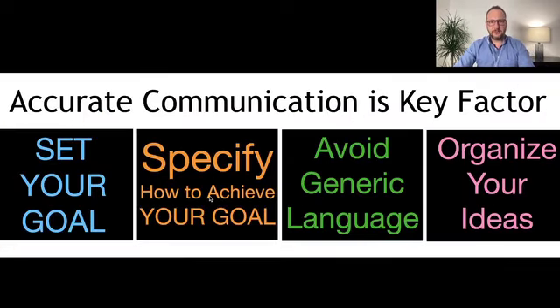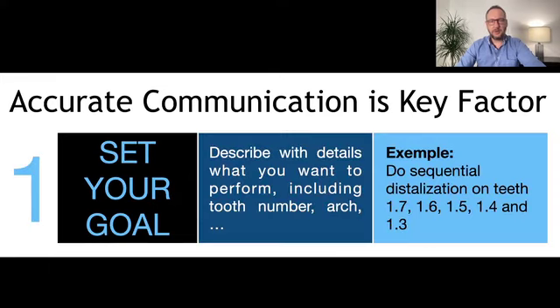So these are the final tips here about staging that you maybe can use tomorrow if you want, okay? But it's going to serve for us to understand how we're going to plan the cases in the future webinars, okay? So you need to follow these 4 steps here when we are going to write to the company asking for some specific staging, okay? First, you need to set your goal, okay? Then specify how to achieve your goal, and then avoid generic language, and then ideally organize your idea.